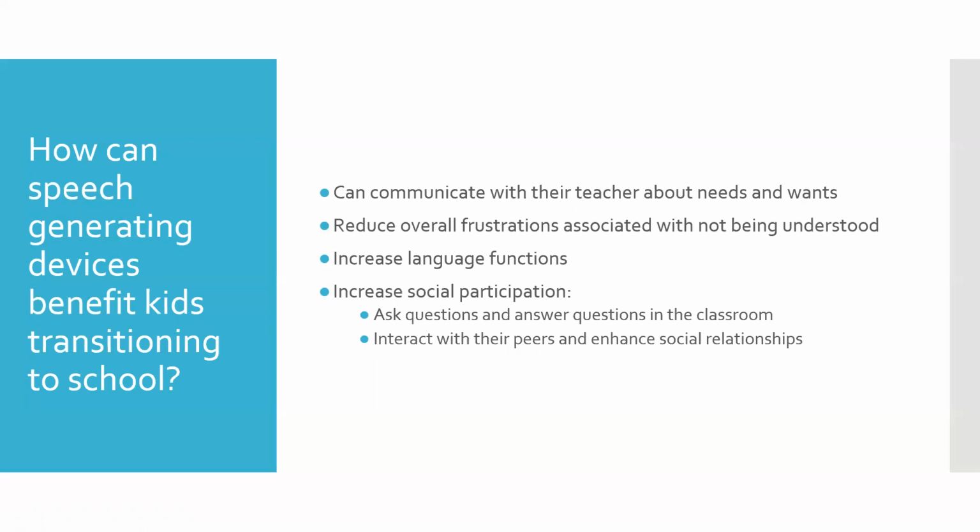Speech-generating devices can increase social participation. For example, the student can ask questions and answer questions in the classroom so that they can be more actively a part of the classroom. And students can also interact with their peers, and this will enhance social relationships.